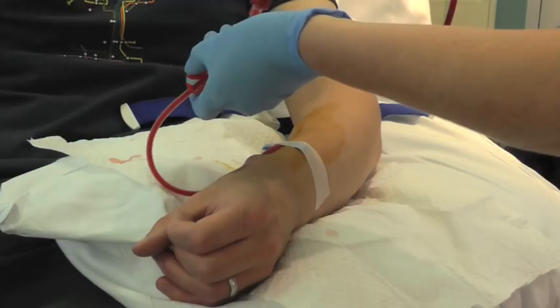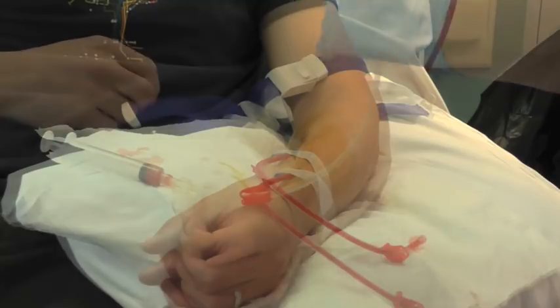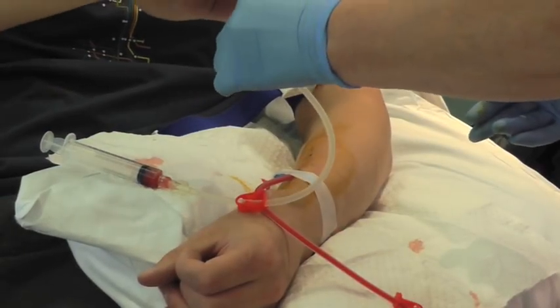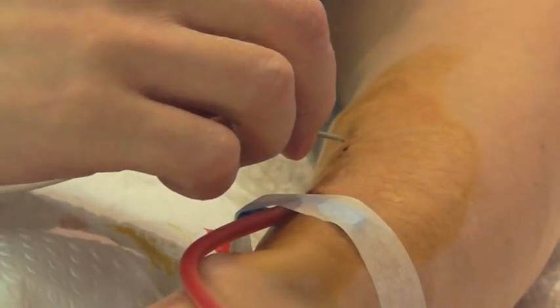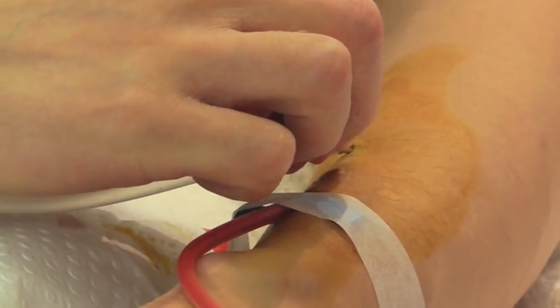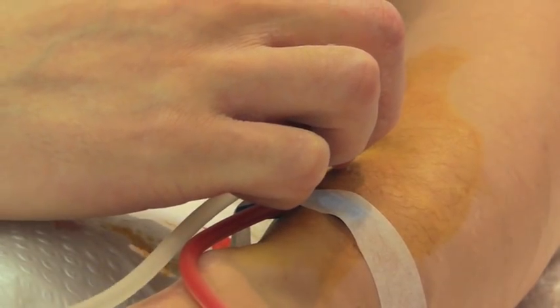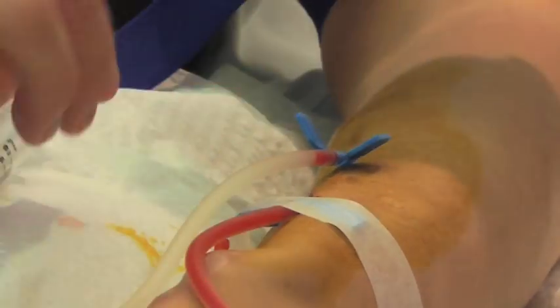Once the needle is in the fistula it should be flushed and the next needle inserted. Needles should be inserted at an angle of no more than 30 degrees. This depends on the depth of the fistula but most fistulas are not so deep that they need a steeper angle.